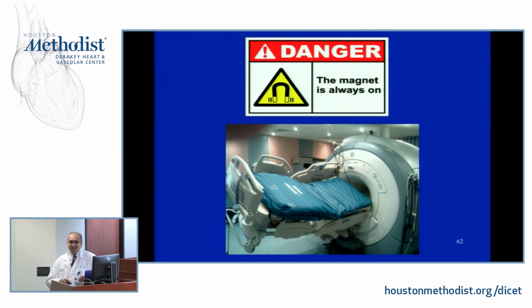And there have been reported cases of patients undergoing imaging who are getting short of breath, and somebody says, let me go take an oxygen tank into the room, and that oxygen tank flies, and patients have died from this. So the first thing to recognize is you can't take ferromagnetic objects into the room. Now, what do I mean by ferromagnetic? Those are objects that are attracted to a magnetic field.